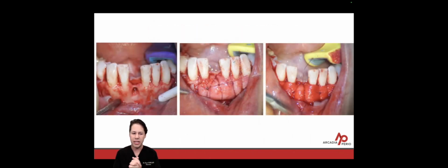So what I want to do is show you some photos from the surgery when we did the augmentation. So, yes, it's a one tooth defect. However, I know I need good blood supply, good vascularity, so there's going to be a large incision design to treat this one mandibular tooth defect. I also know I want to address the soft tissue component simultaneously with this ridge augmentation. So let's look at the photos from left to right.